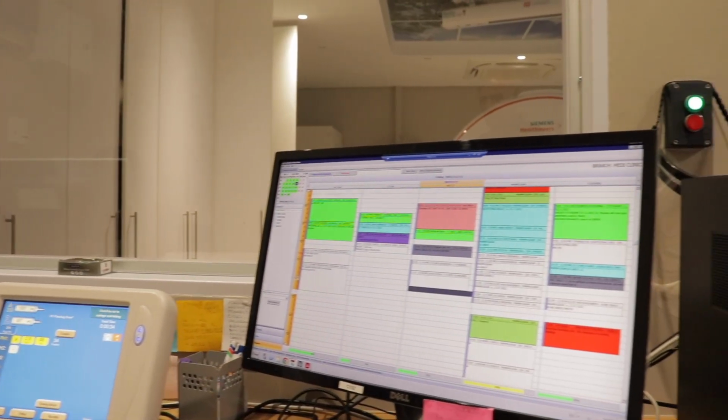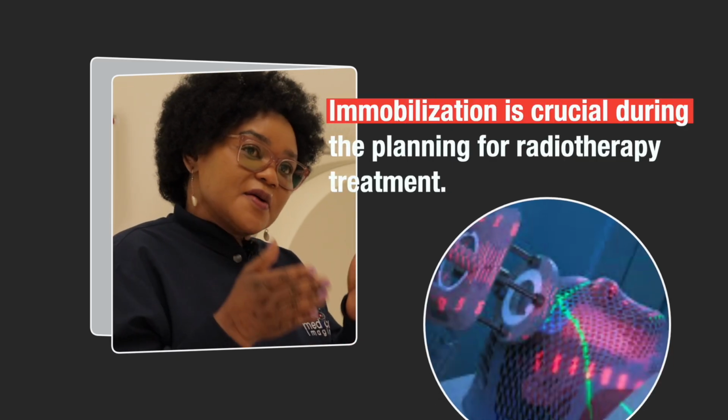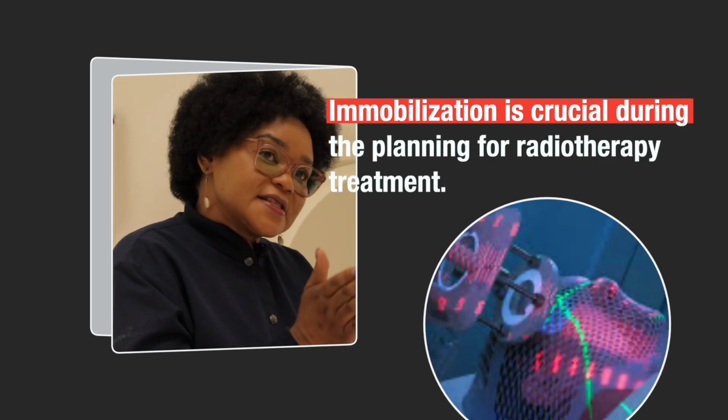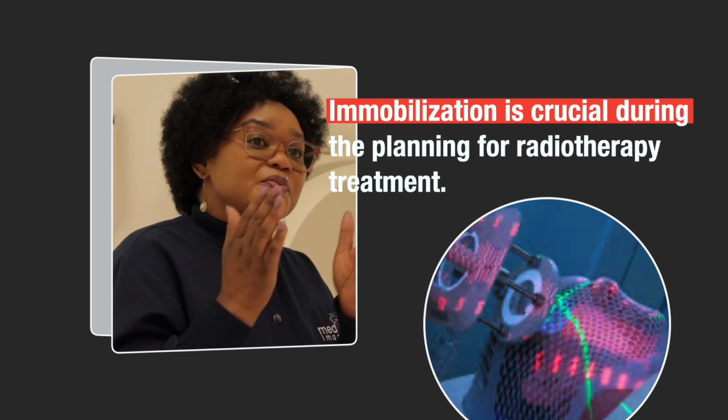And the field that we are going to scan, they have to use it to focus their treatment on that same area. So they have to see the area first before they put the patient on the treatment machine, so that they can just focus on that area that they are treating.